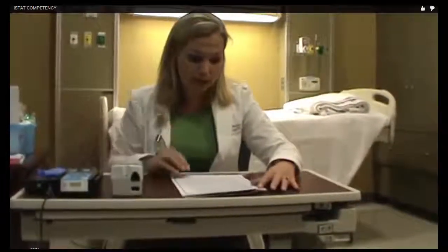Again, you cannot run a patient if you don't perform the simulator. Specimen collection is pretty straightforward. It takes a very small volume, about 95 microliters. So if you draw 1 mL in a straight syringe, you're good.